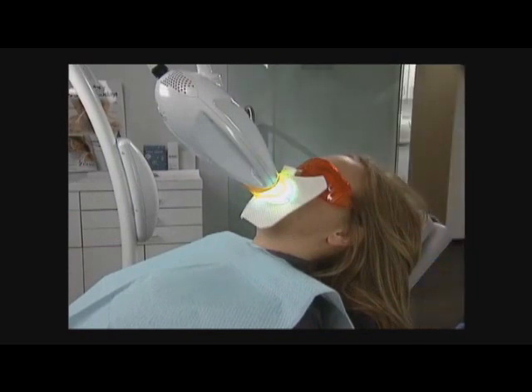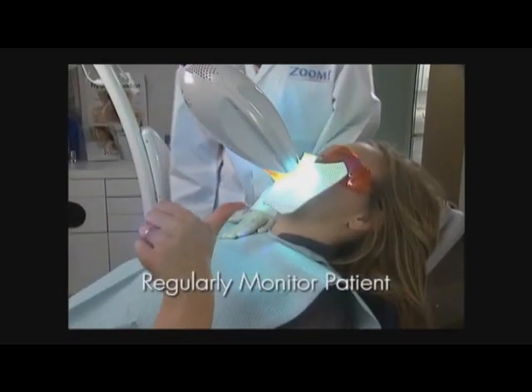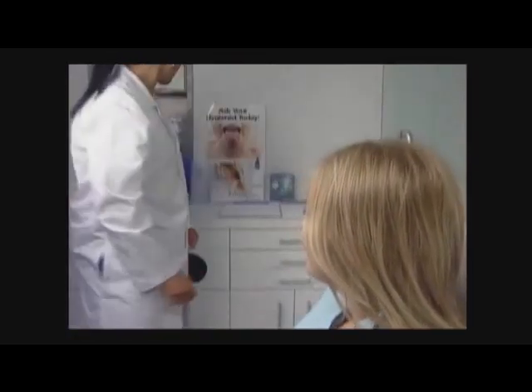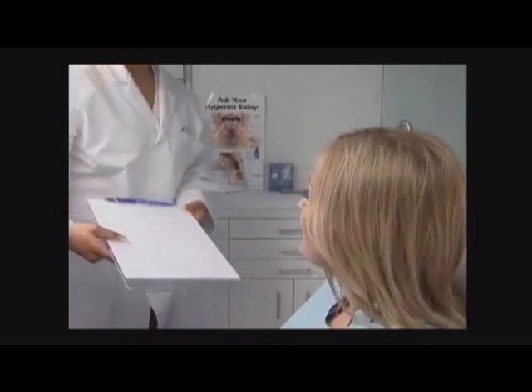It is normal for the light to flicker for the first few seconds. Be sure to check on the patient regularly during this period. If you plan to leave the room for an extended time, provide the patient with a means to contact you, such as a small bell. It is also helpful to have a paper and pencil available in case the patient needs a means of communication.